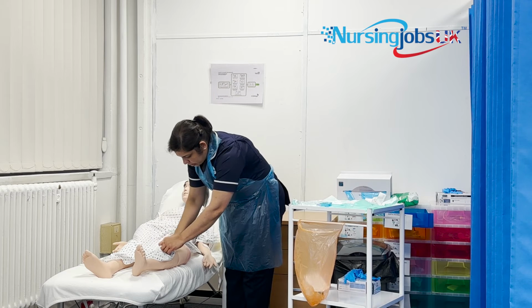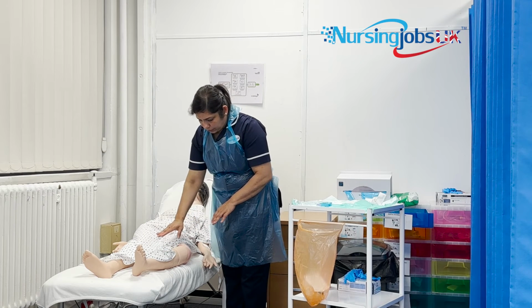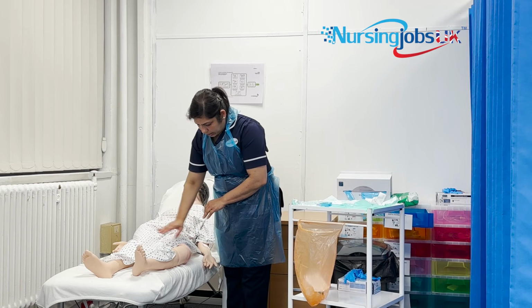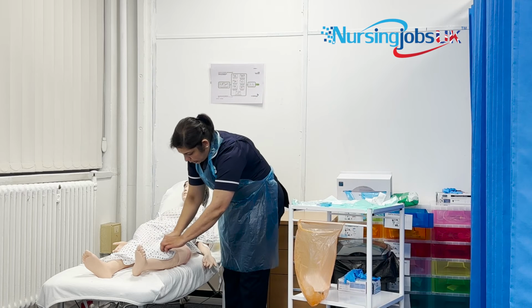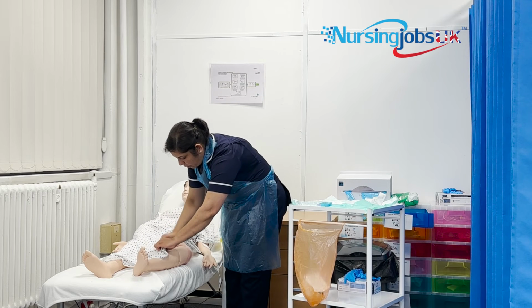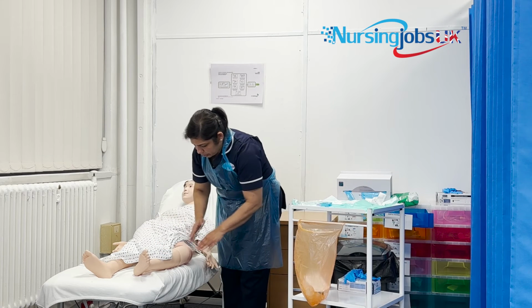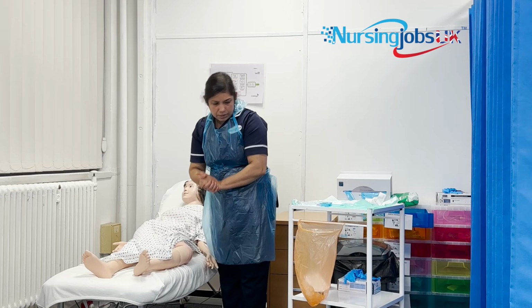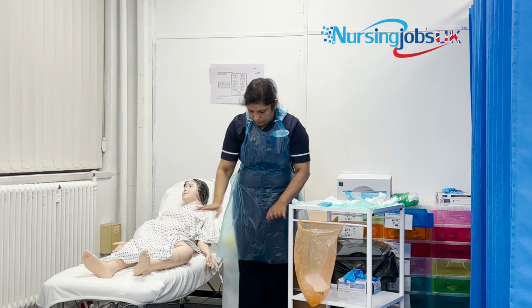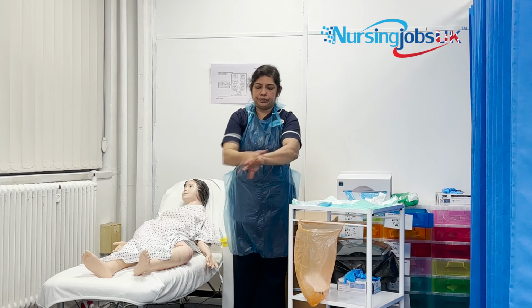Okay. So you just need to expose a minimal area, whatever how much the area you needed, but always make sure that when you are folding it, fold it correctly so that it won't be coming back to the area as well. Okay, so the patient is prepared now. Now everything is okay, so I can just wear the sterile glove.